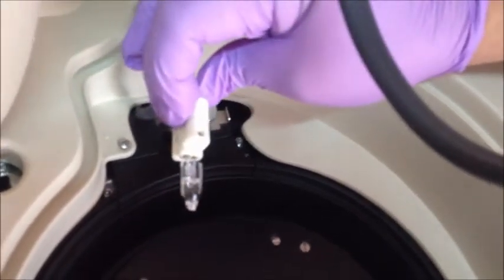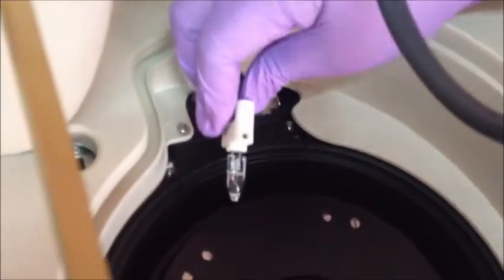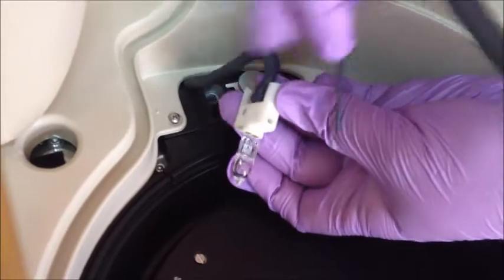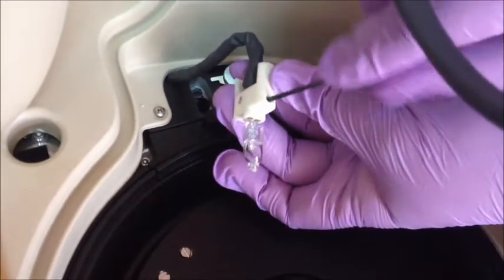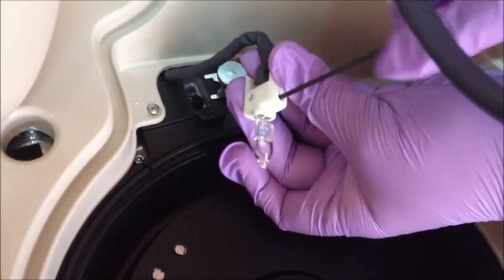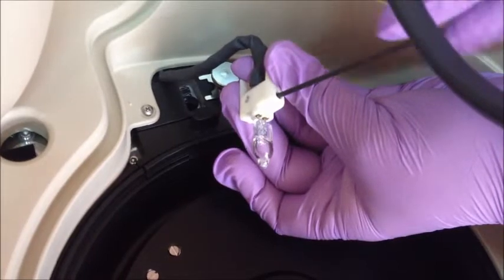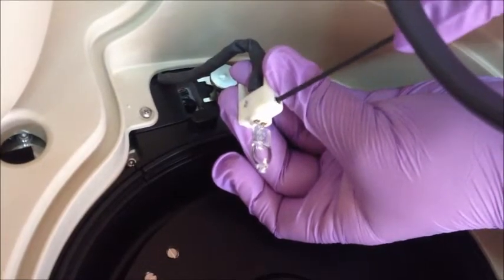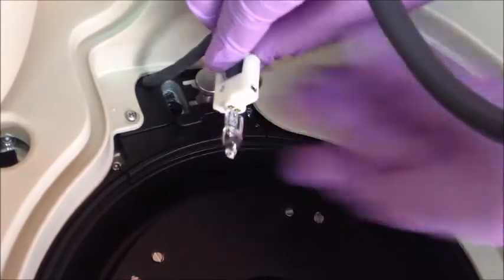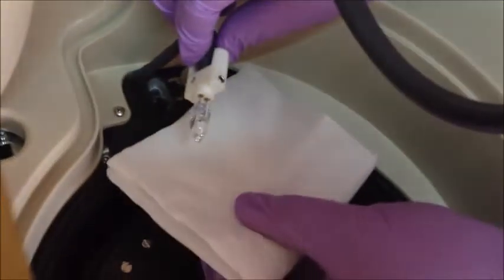Check the screws on the lamp holder, and loosen these screws to remove the lamp. Remove the lamp carefully — you may use tissue or gauze when doing this.